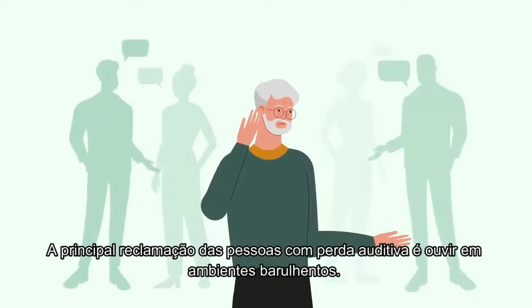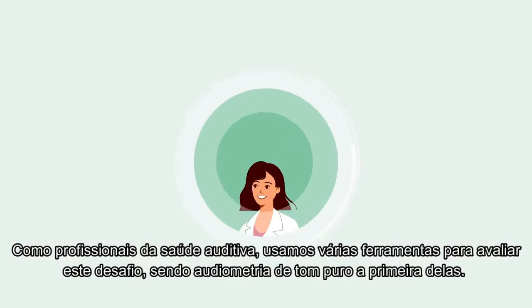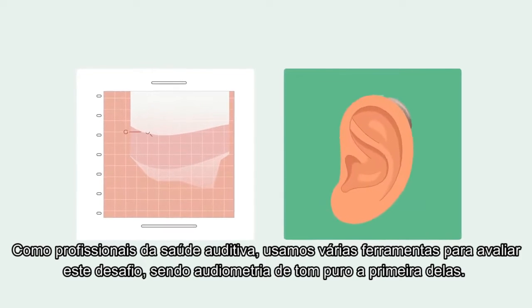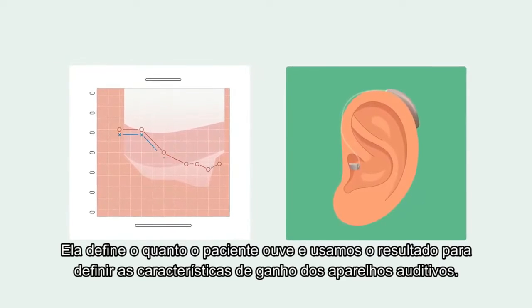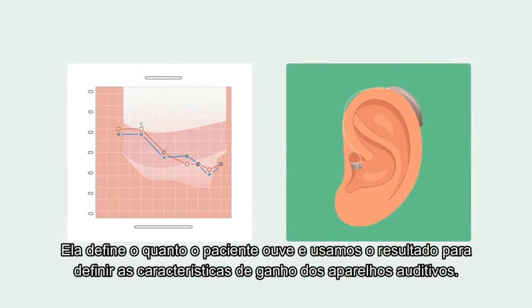The number one complaint of people with a hearing loss is hearing in noise. As hearing care professionals, we have developed tools to assess this challenge. The first tool in our toolbox is the Pure Tone Audiogram. It defines the quantity of hearing, and we use the results to set the gain characteristics of hearing aids.